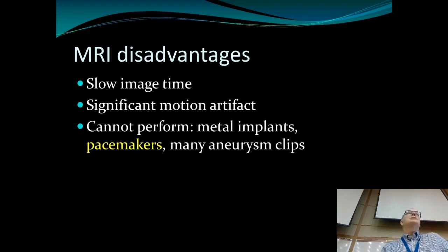So we need to ask these questions before we send the patient down to the MRI scanner. And the radiology technicians will also ask the same questions again. So there's kind of a double screening here, but it's bad form to send someone down for an MRI who has a pacemaker.